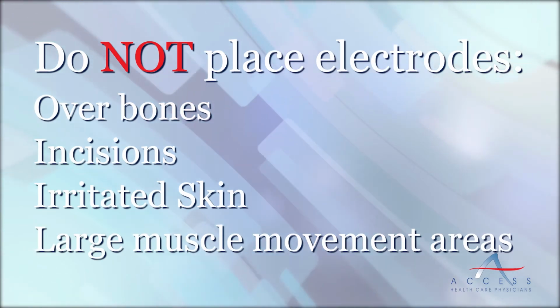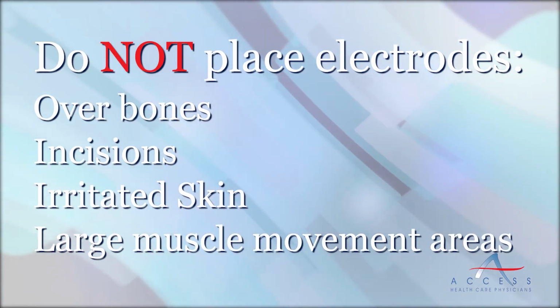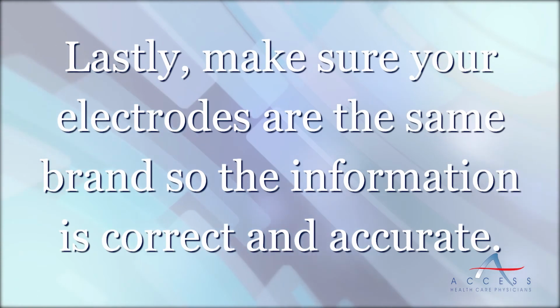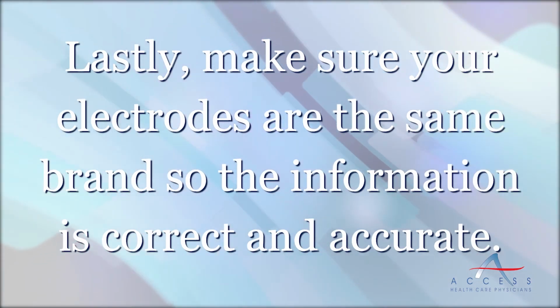Do not place electrodes on skin directly over bones, incisions, irritated skin, and body parts where there are lots of possible muscle movement. Use electrodes of the same brand. Using different brands with dissimilar composition can hinder an accurate EKG trace.